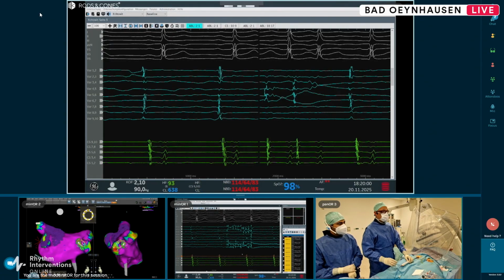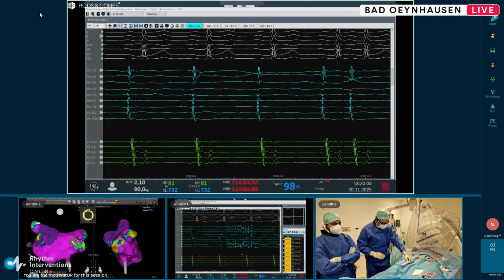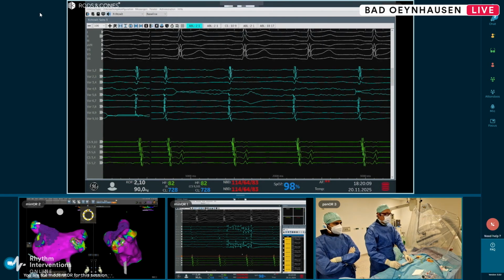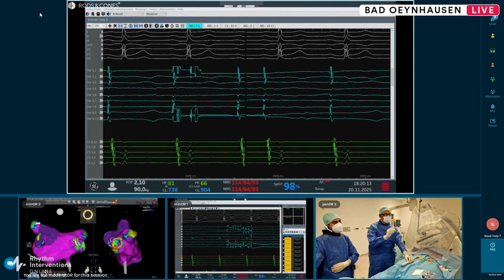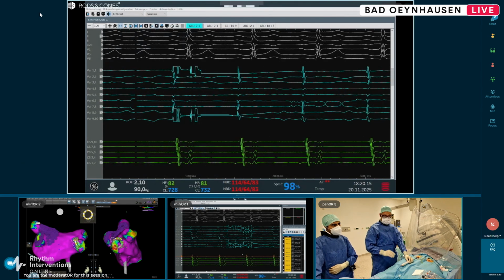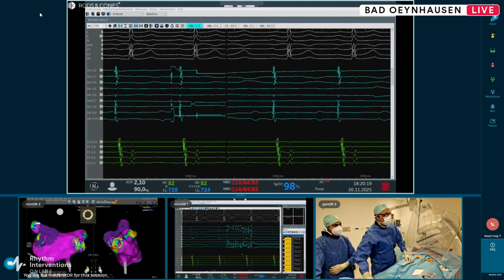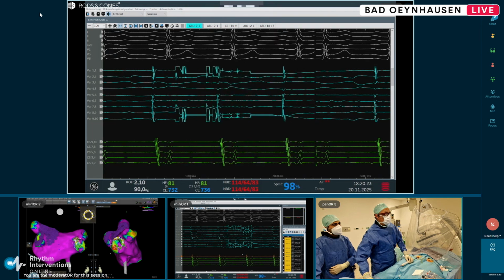We move to the right veins. That was a very clear and easy move. We can also now check the fluoroscopy. Maybe we can highlight this just for a second. We have the fluoroscopy. We push a little bit more forward. You see that we're getting better TPI now. 6 is not 100%. Therefore, I will now open the catheter a little bit to get more tissue contact.